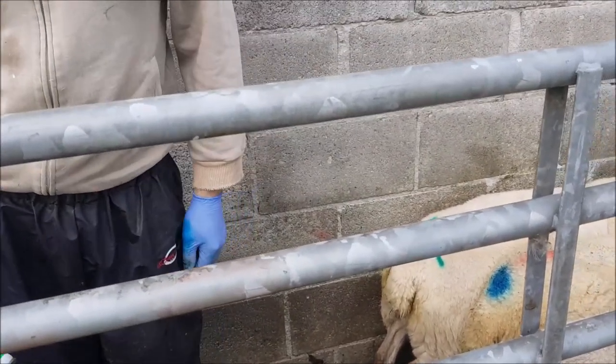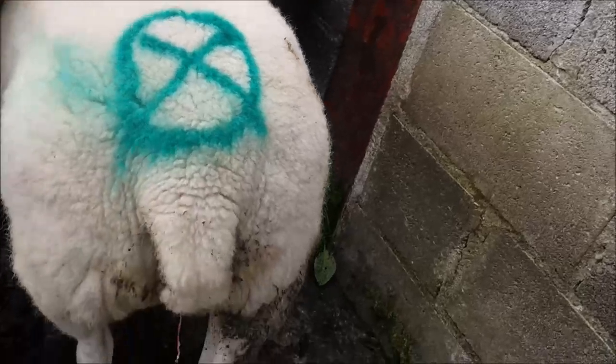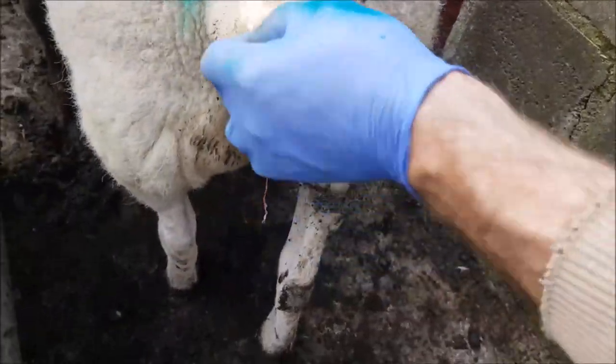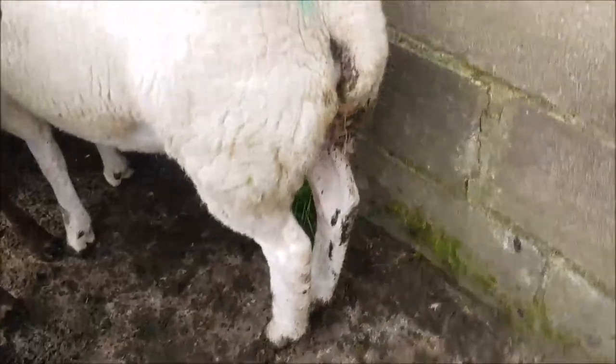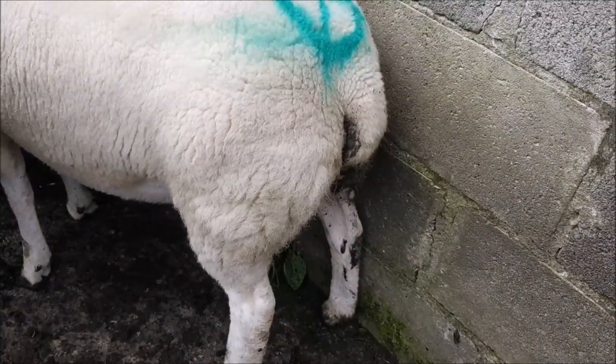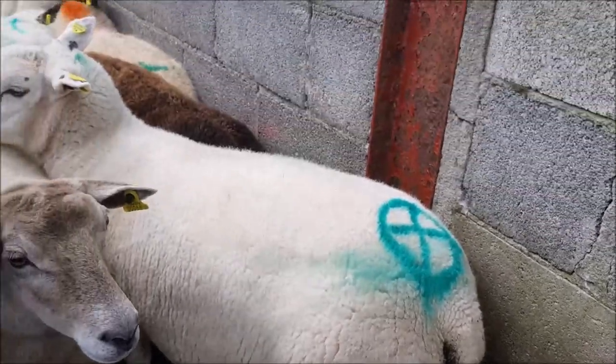So that is it. There is one there — just a hogget. We put a circle over the X. You can see blood on the string — she never had a lamb before. I don't know how successful it is going to be, because the sponge has only gone in about 2 inches, but it should really go in about 6 inches.